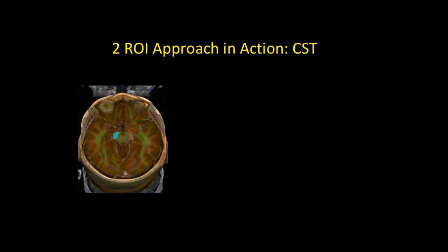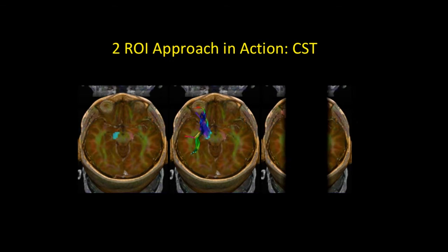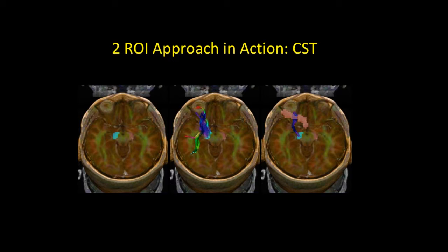We use a two-point approach. First, you place the seed point in the cerebral peduncle, which is blue in this case, and then you create fibers with your post-processing software. There are too many or spurious fibers on this one-point approach, so then we create a second point, an inclusion point, in the ipsilateral motor cortex, in this case pink, to connect the two points.